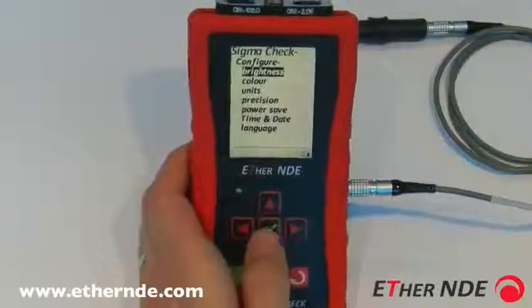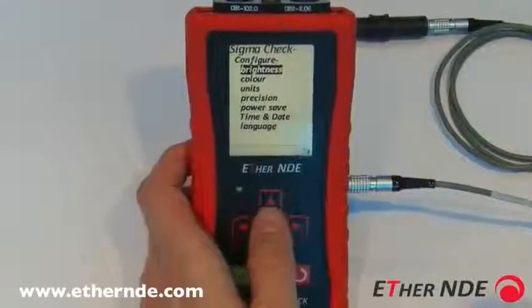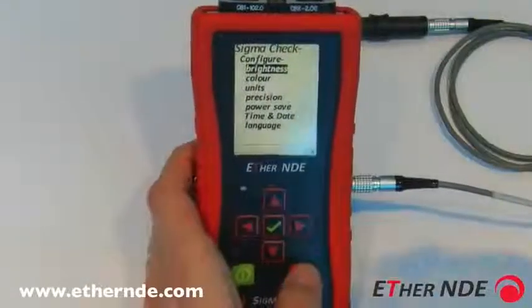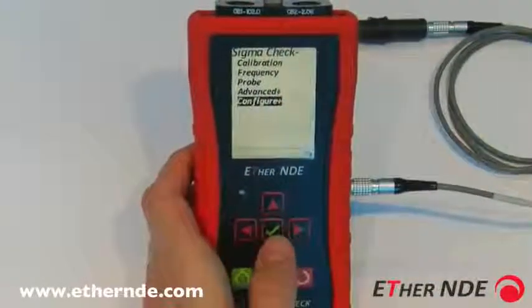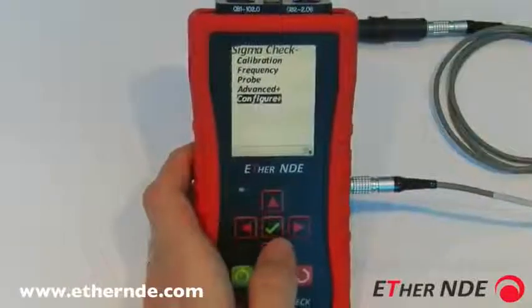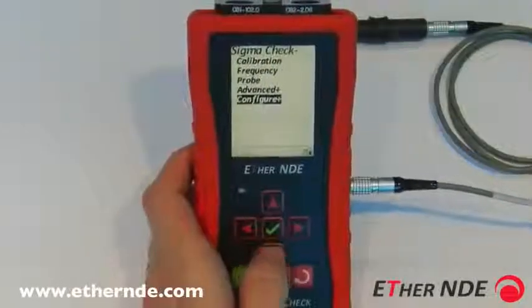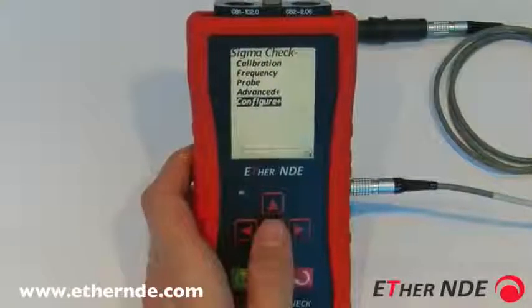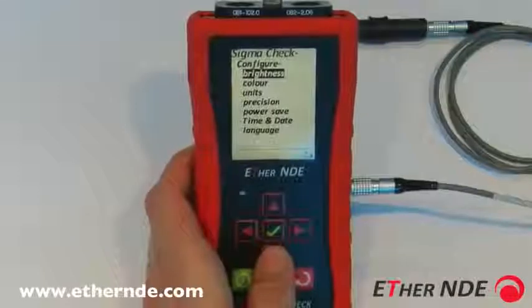If you go into brightness and change the brightness but do not wish to keep the current setting, pressing back will revert to the previous value.